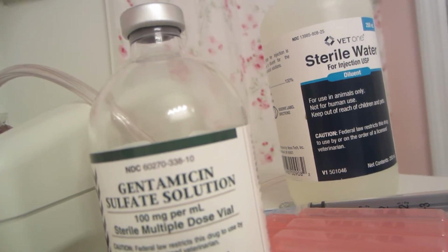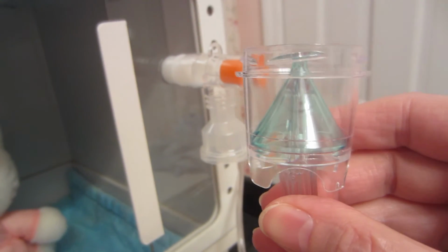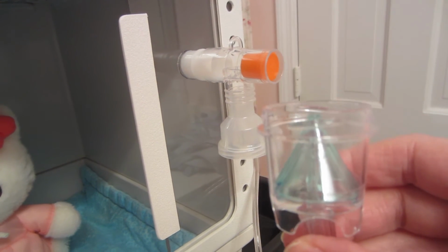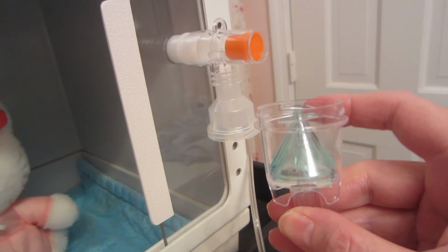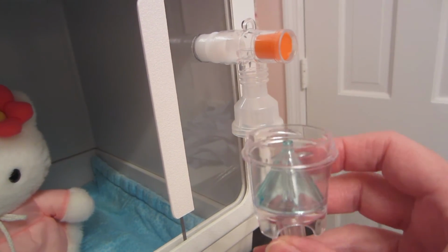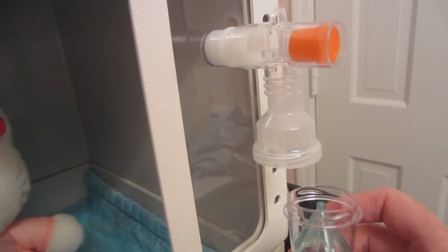You want a total of 6 to 8 cc's of liquid in the bottom of the nebulizer. So if I've added 2.5 cc's of gentamicin, I'm going to need about 4 to 5 cc's of water in the bottom of the nebulizer. You just want it full. You want to get a full 20 to 30 minutes of nebulizing time for your cat. So you may have to adjust the amount of water you add as you figure it out the first couple times.